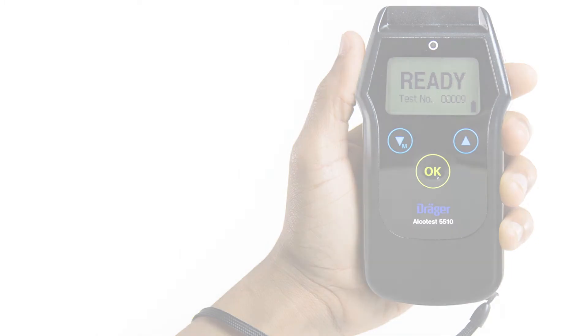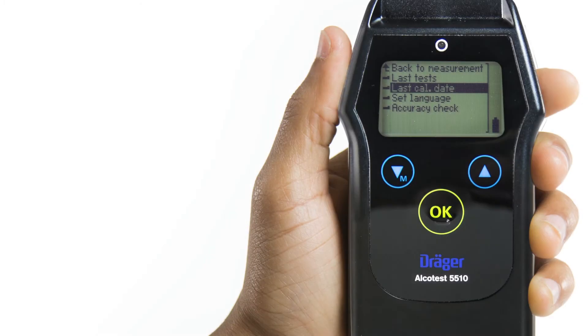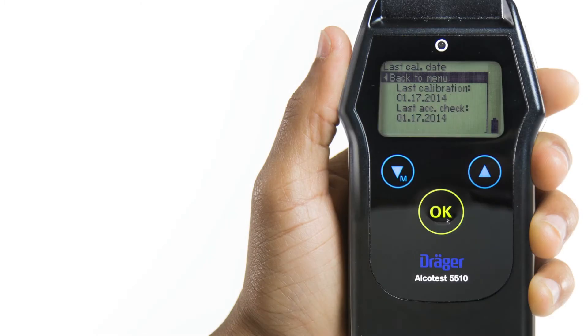The Last Calibration Date menu displays the date of the last calibration.